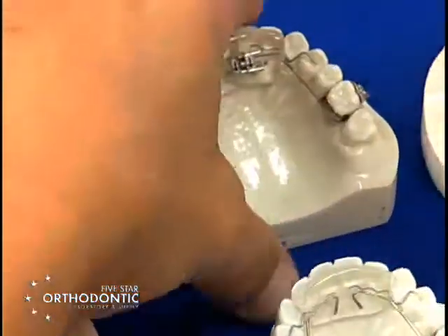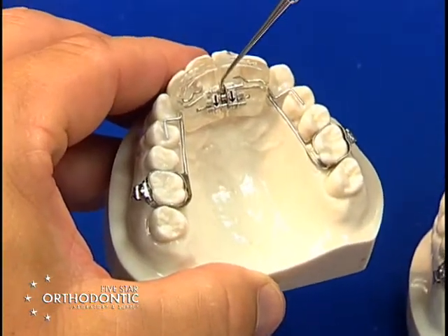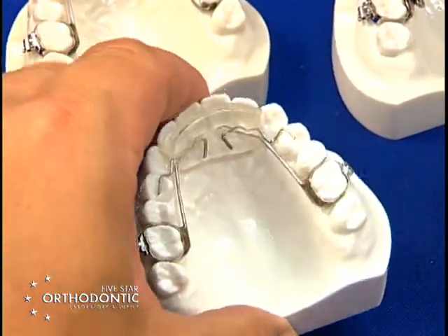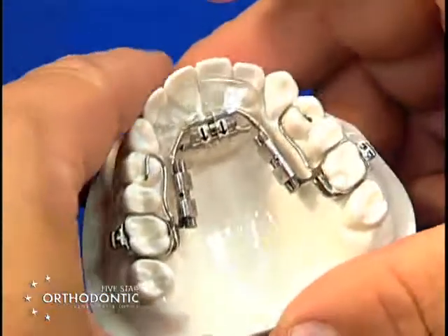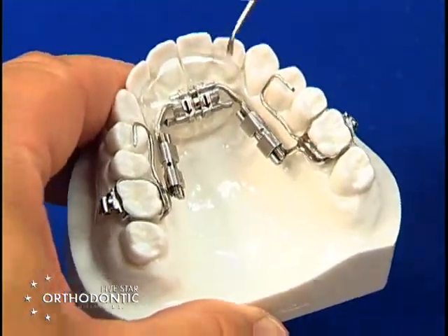You have Rickonators which have multiple options. You can place gears in the Rickonator Plus, or use a standard Rickonator that is used to open the bite and bring the mandible slightly forward. You also have barrel fixed three-ways to drive the anterior section forward, develop transversely, and move sagittally.